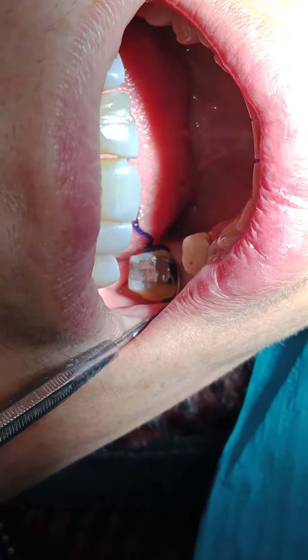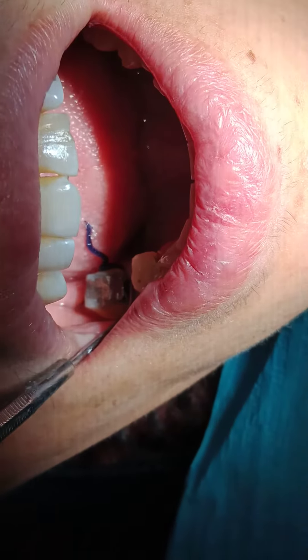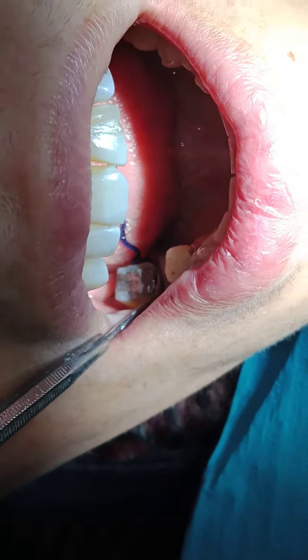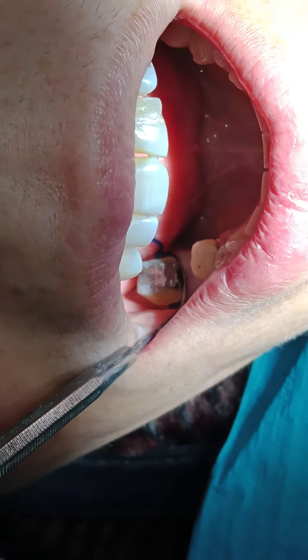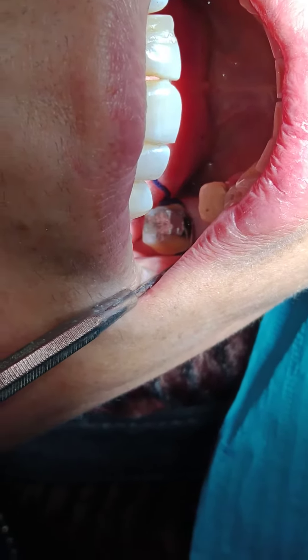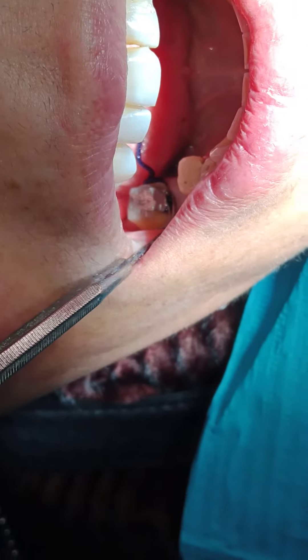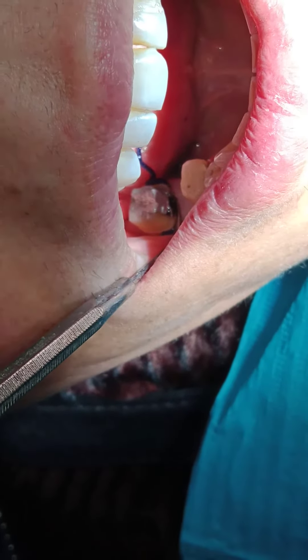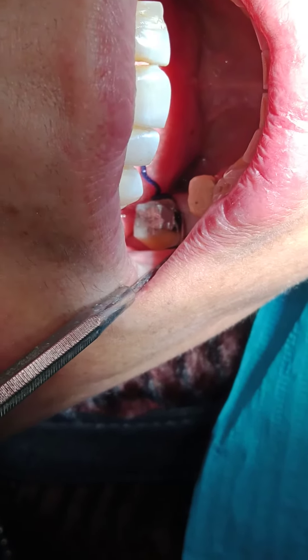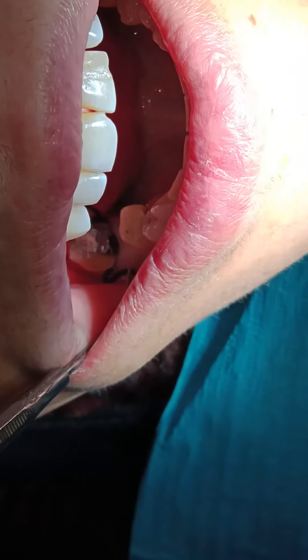So when I'm preparing, going apically with my preparation and I still don't see the retraction cord, that means I still have vertical space to go in. The pocket is still deeper. So I'm not invading the depth of the pocket and I'm not invading the junctional epithelium. I keep preparing more apically until the beginning of the retraction cord appears — that means I could not go more apically without surgeries and crown lengthening. So all of these are functions for the retraction cord; they help me and they guide my preparation.